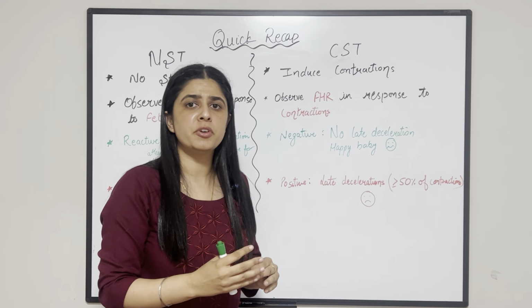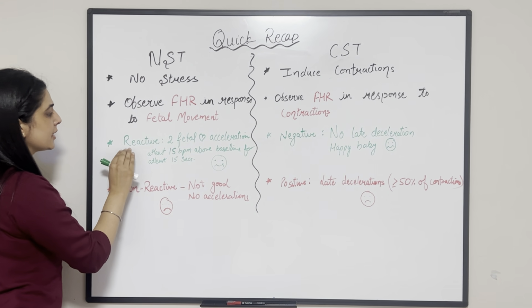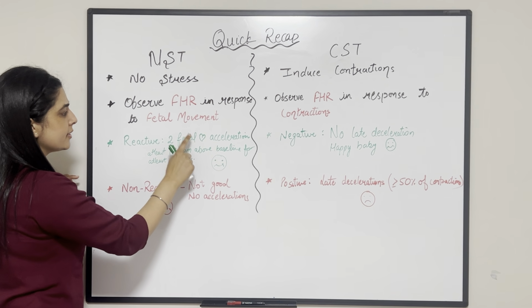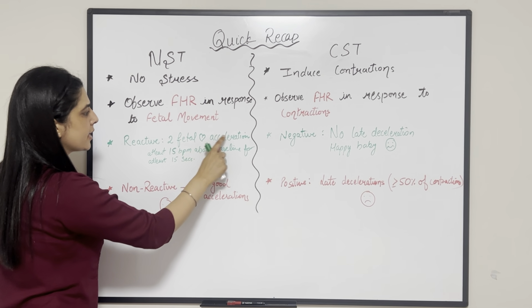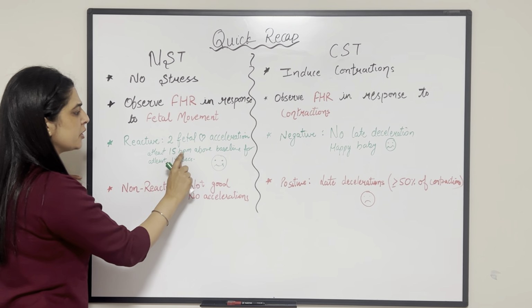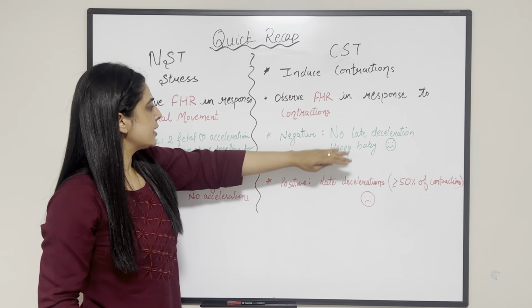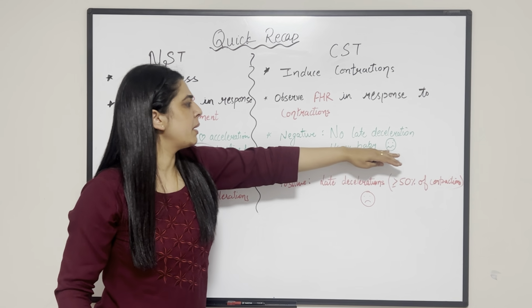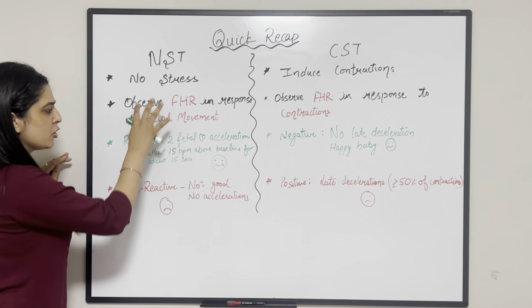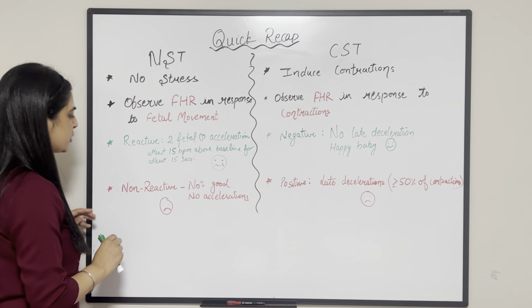So how does the fetus respond to stress? In NST, if your test is reactive, that means your fetus is having two fetal heart accelerations in at least a 20-minute period, at least 15 beats per minute above the baseline for at least 15 seconds. If CST is negative, no deceleration, your baby is happy. So in NST, if the test is reactive, your baby is happy.